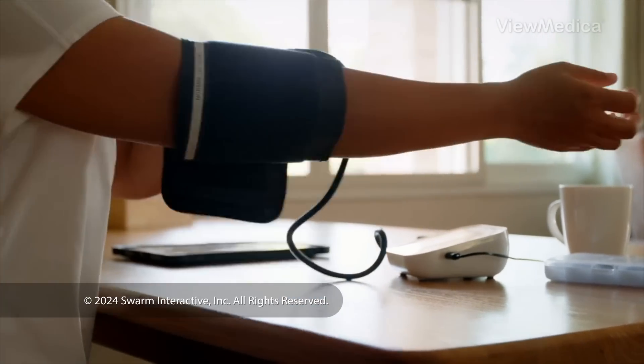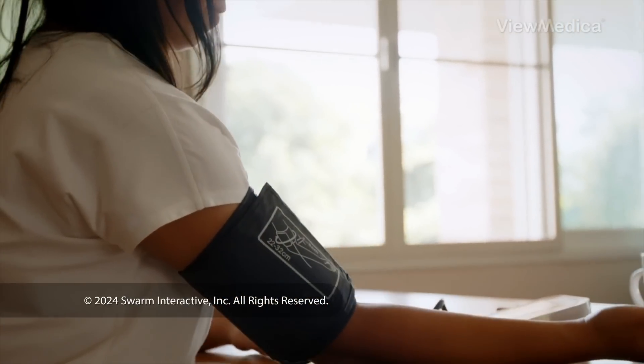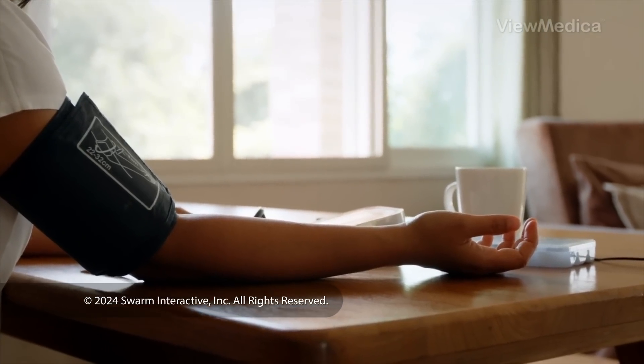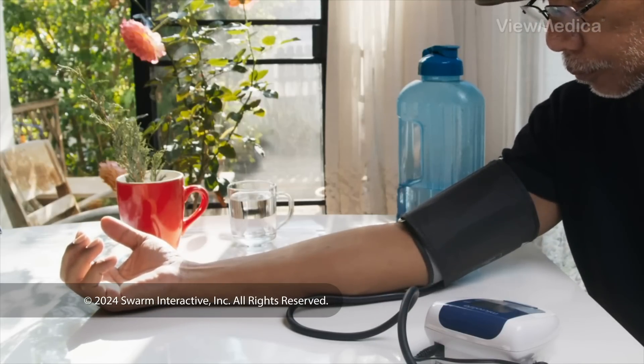Now it's time to take the measurement. Put the cuff on your bare arm, not over clothes. The bottom of the cuff should be just above your elbow. Sit upright in a chair with back support. Your feet should be flat on the floor and your arm should be supported at heart level. Don't talk during the test.